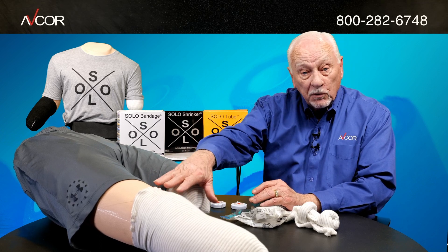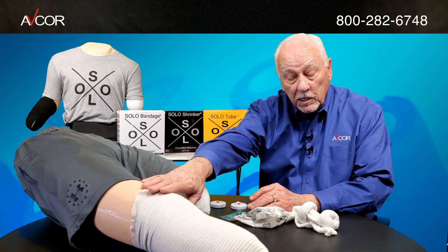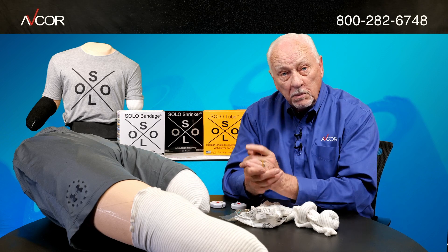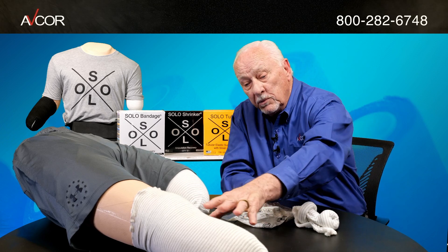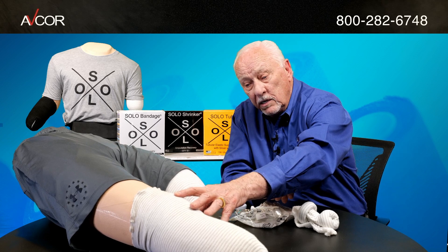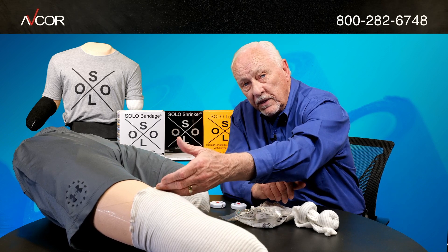The product comes in both short and long lengths. It does require fitting, so you will need to take one measurement — come up to the widest point above the amputation site and then take a measurement of that area.